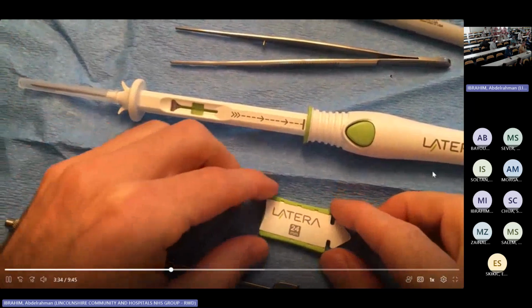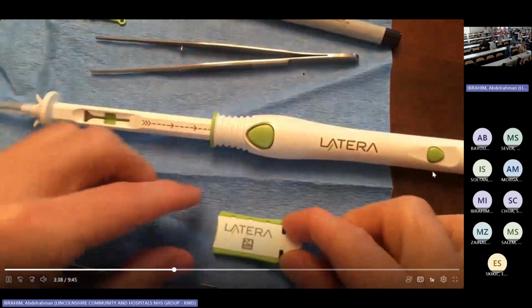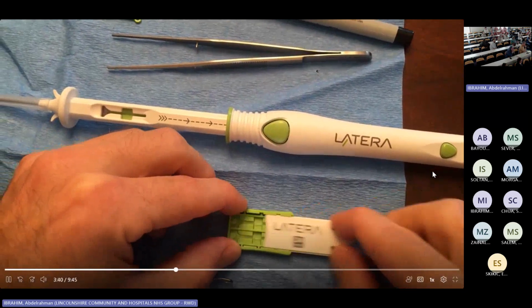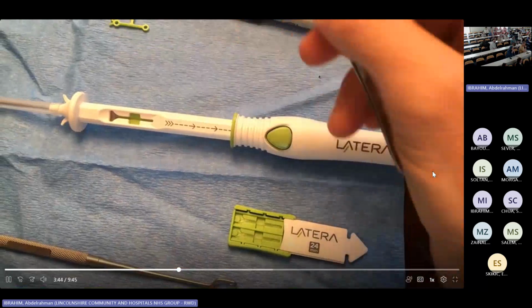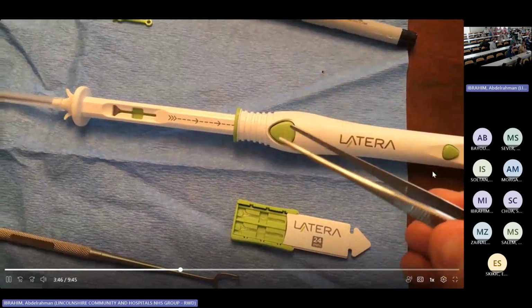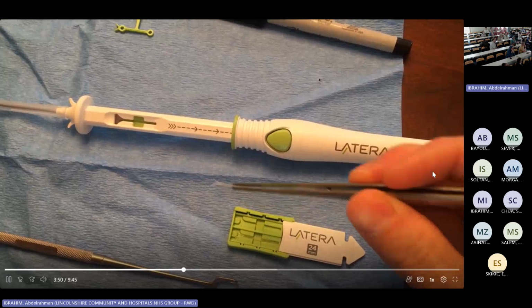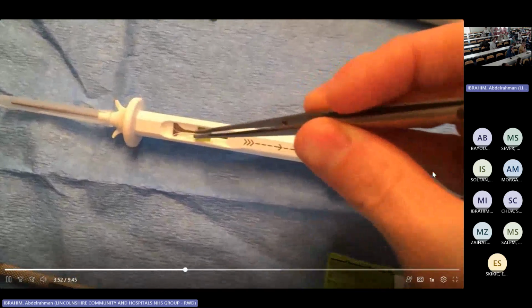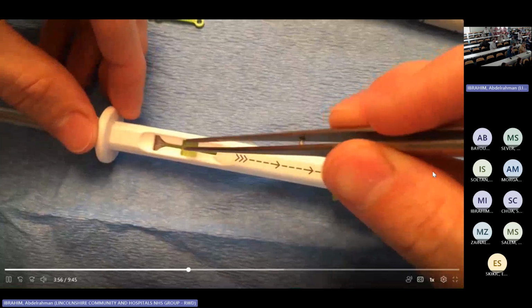The implant tray I will open. I will want to make sure these are aligned, Latera and Latera, so that the distal forks are oriented towards the cannula. I will take my smooth forceps pickups, play the game of operation and drop the implant into the loading port. Make sure it's fully seated.